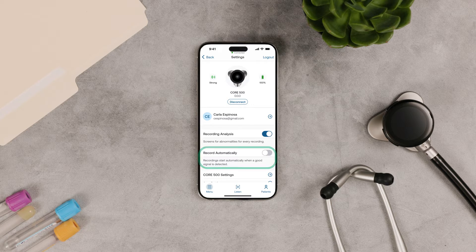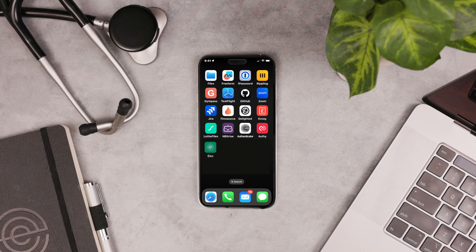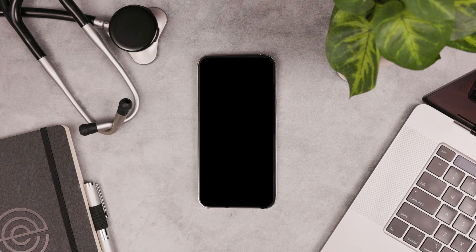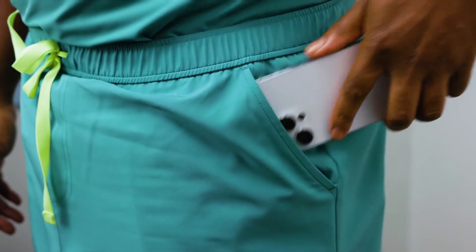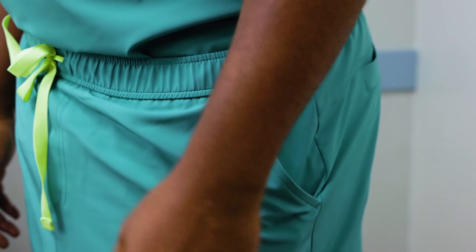Or you can just start them manually. Navigate away from the app or put your phone to sleep, making sure the app is still active in the background. Put your phone in your pocket or set it aside, but keep it near your Core 500.